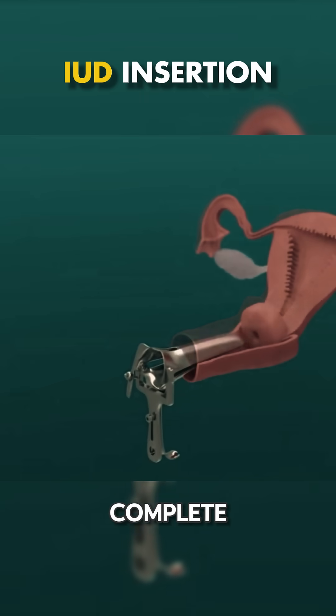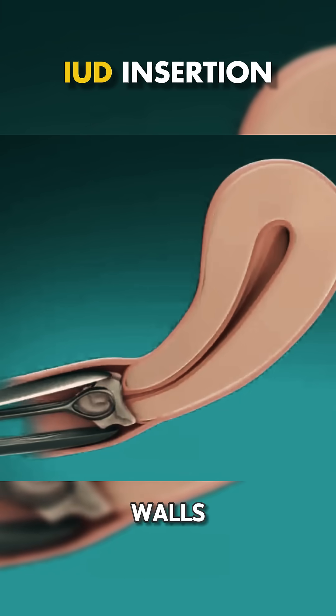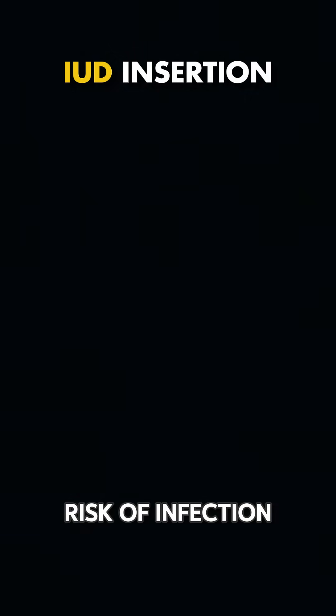Once this assessment is complete, a speculum is used to gently open the vaginal walls, allowing a clear view of the cervix. The area is then cleansed with an antiseptic to reduce the risk of infection.